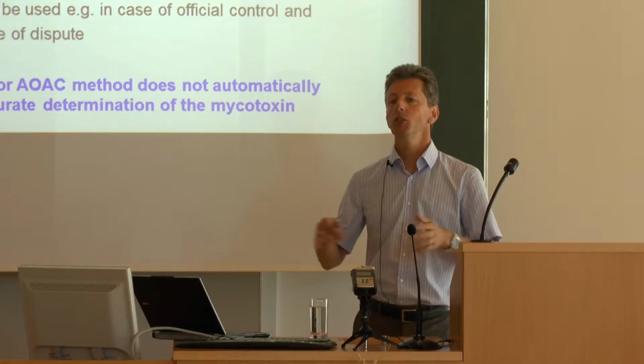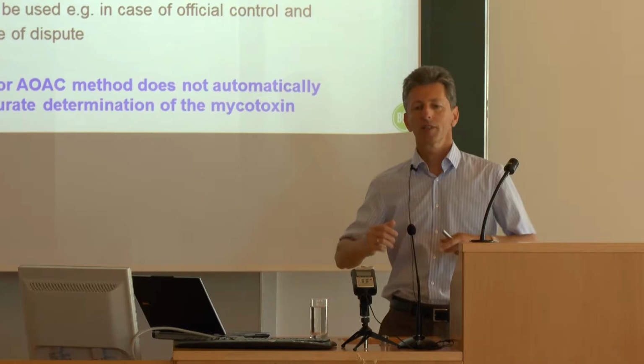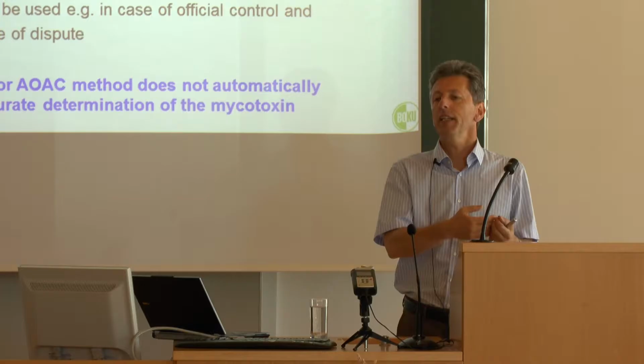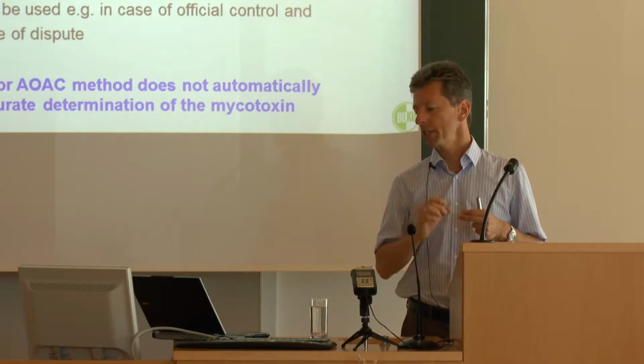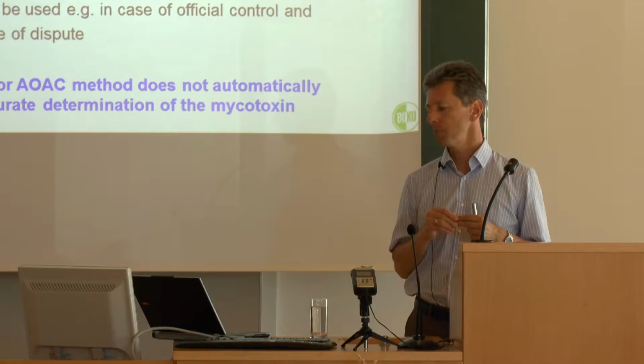You can use an AOAC approved method. It's a clearly described method with a couple of analytical steps. But even if you establish that method in your lab, it's not automatically in-house validated. Neither is it collaboratively validated. The method as such, yes, but you as an individual laboratory are still lacking the final proof that your measurements are comparable and provide you with a high level of trueness and precision, summarized, so to speak, as accuracy.